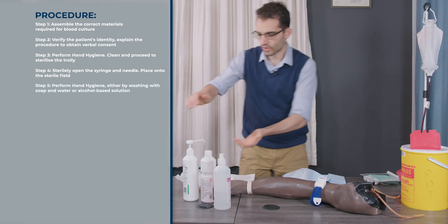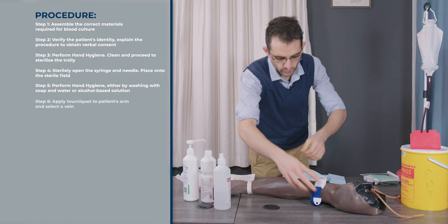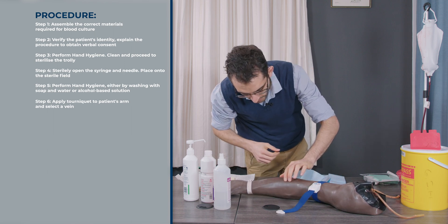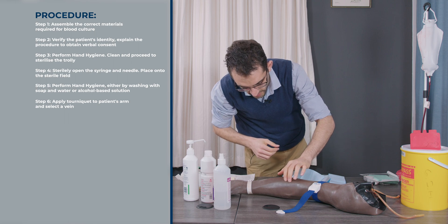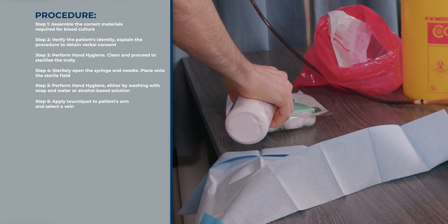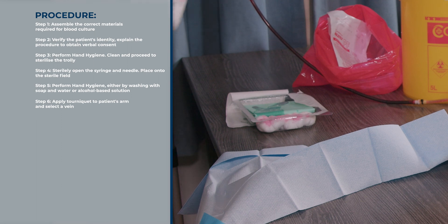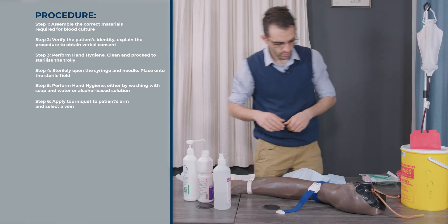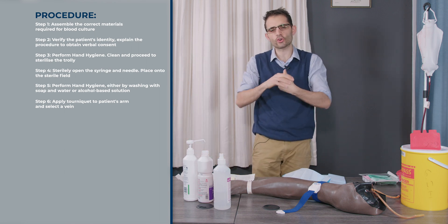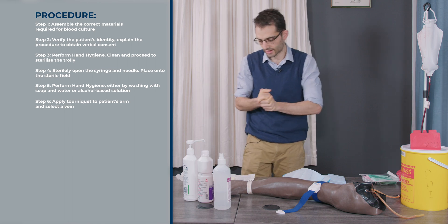Once that is done, you're going to do your hand hygiene again because you need to touch the patient. Put the tourniquet on and palpate your vein. Once you're happy with the vein location, pour your antiseptic onto your cotton wool in the well. Then do your hand hygiene once more before you put on your gloves. Make sure your hands are completely dry, otherwise you're going to struggle to put on the gloves.